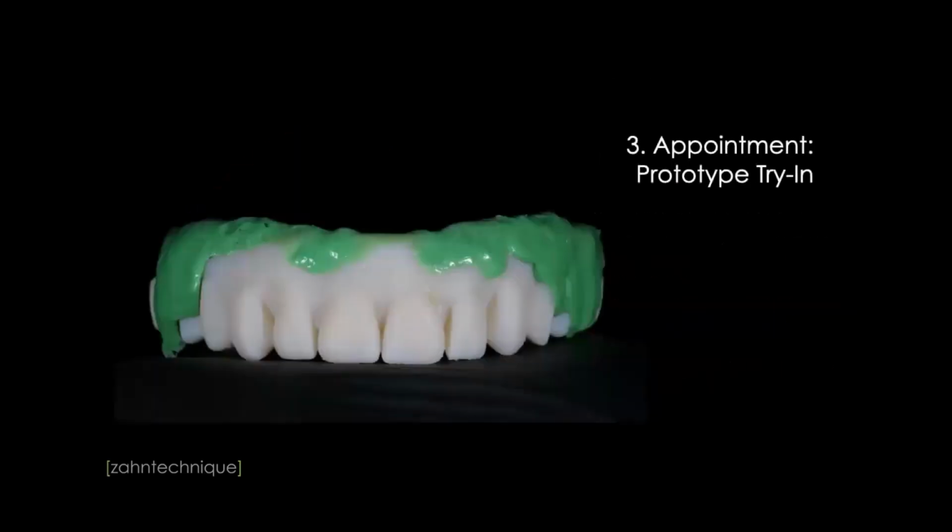So now we're already at appointment 3. The cool thing is now that's all you have to do, and then send us a scan, or send the scan to your lab, right? So we do the rest, and then all of a sudden, appointment 3, right? Exactly. So here we have a printed prototype try-in.